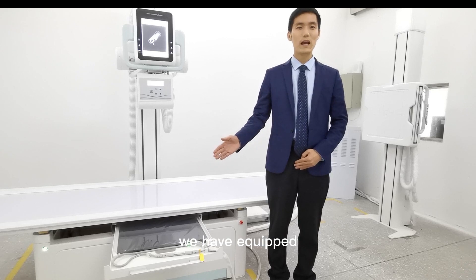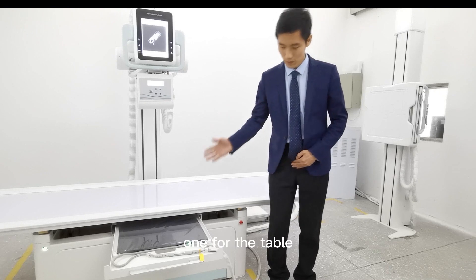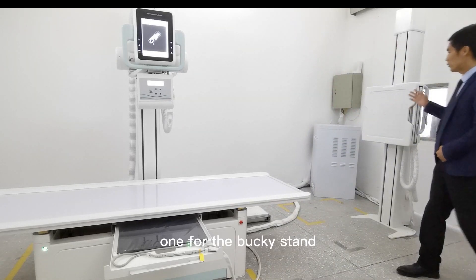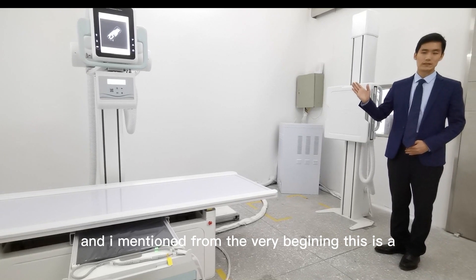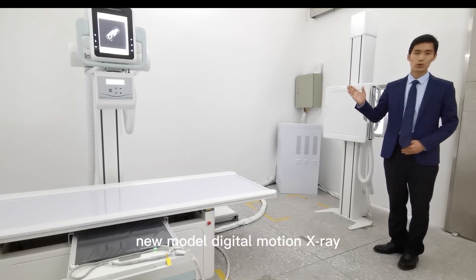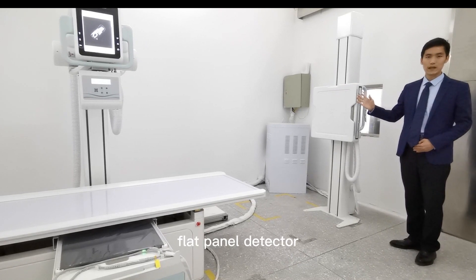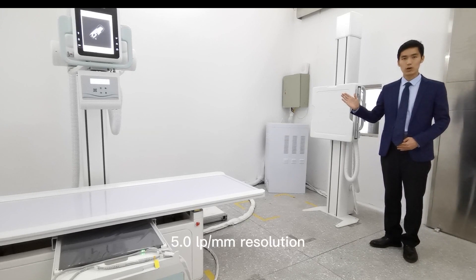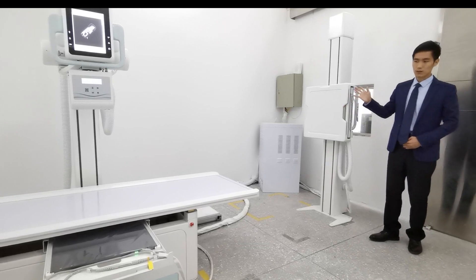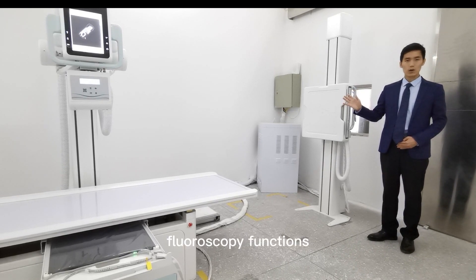For this model, we have equipped the machine with two large-sized flat panel detectors — one for the table and one for the upright stand. This is a new model digital motion X-ray. The flat panel detector is a dynamic flat detector with as high as 5.0 line pairs per mm resolution, very high parameters with broad fluoroscopy functions.